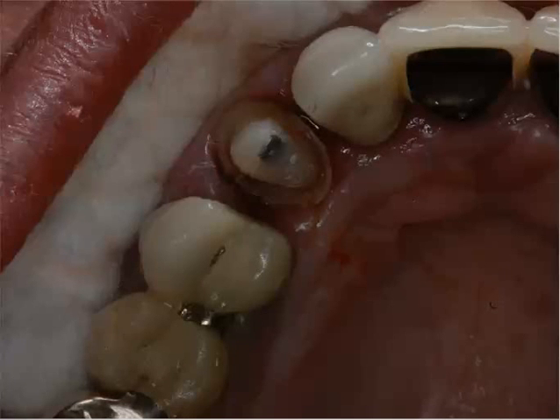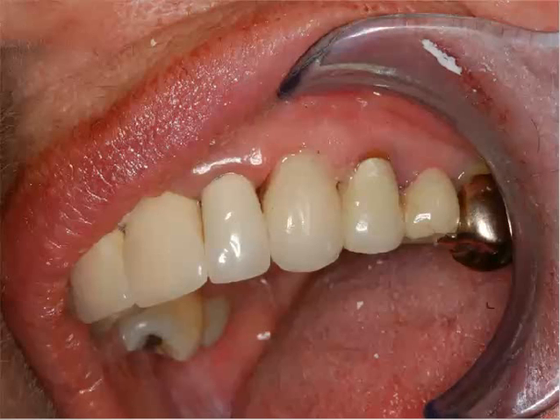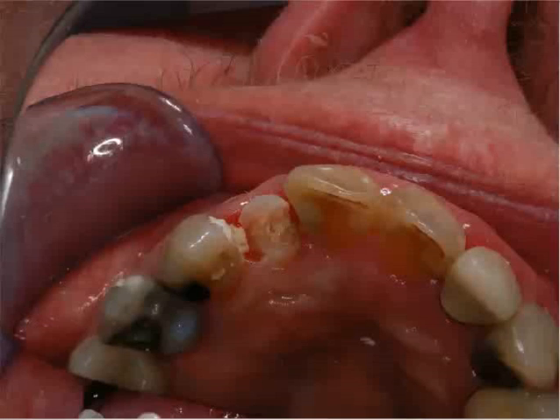Now we have all sorts of access to our margin. We can go ahead and take our material, inject it around there, and then we have really nice well-fitted pressed ceramic crowns we put on. You can see right after being cemented, and the tissue response is really favorable.